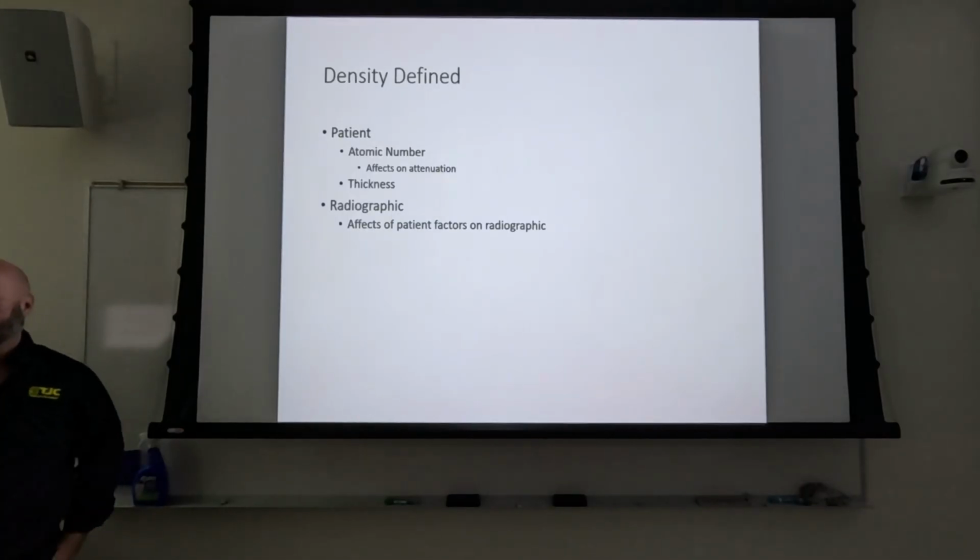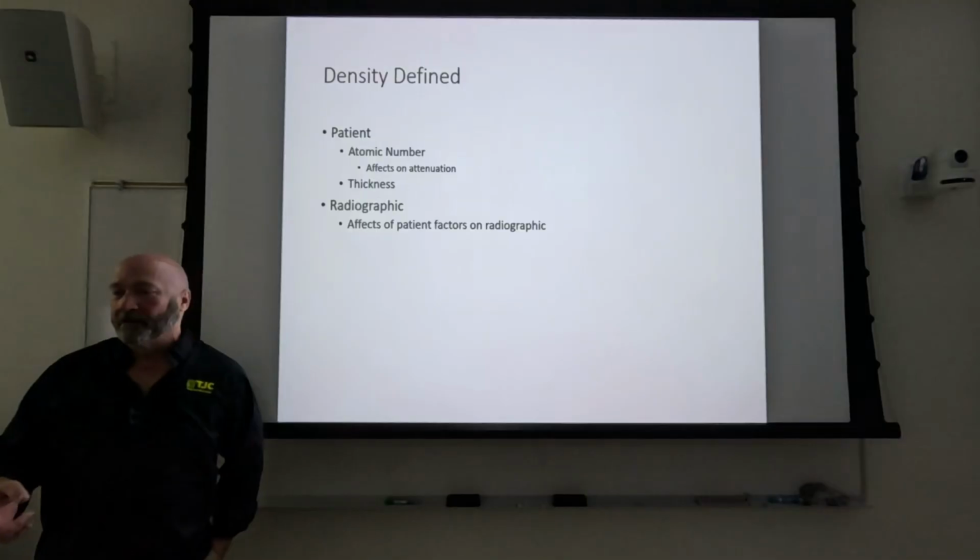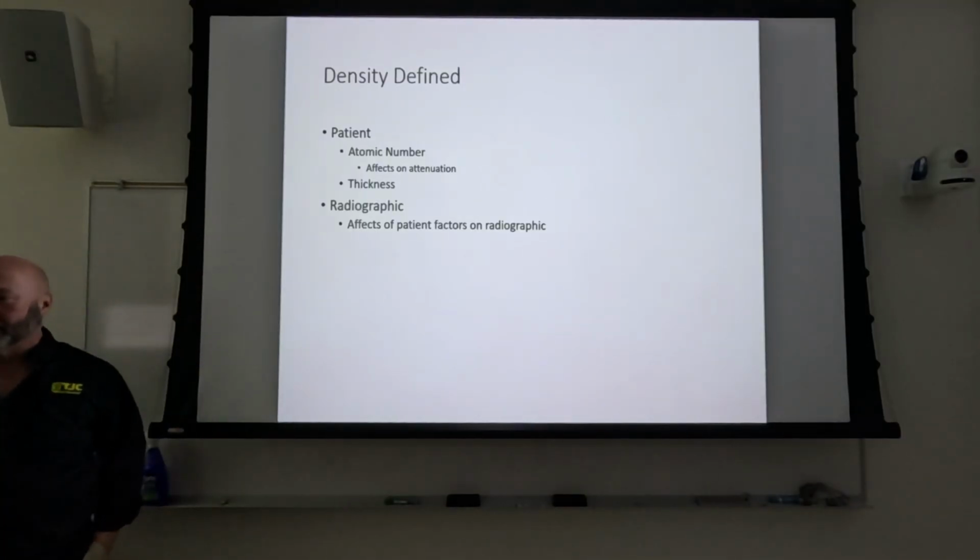Pretty low. Well, just fat. Okay. Right, is that not... Is it going to include everything? Yeah. So it's got to include everything that goes into that fat, right? So that's the Z effective. Zeff means Z effective. That's the effective atomic number of the tissue.